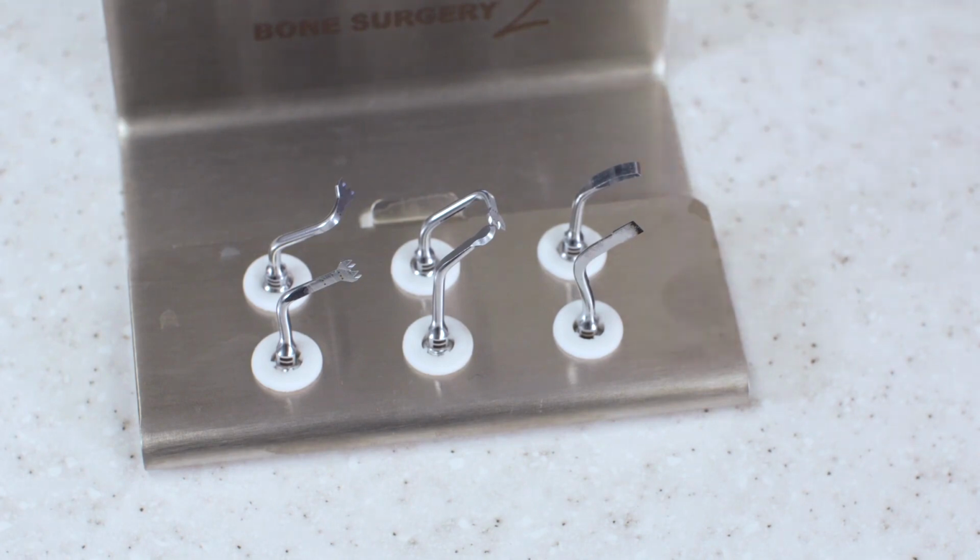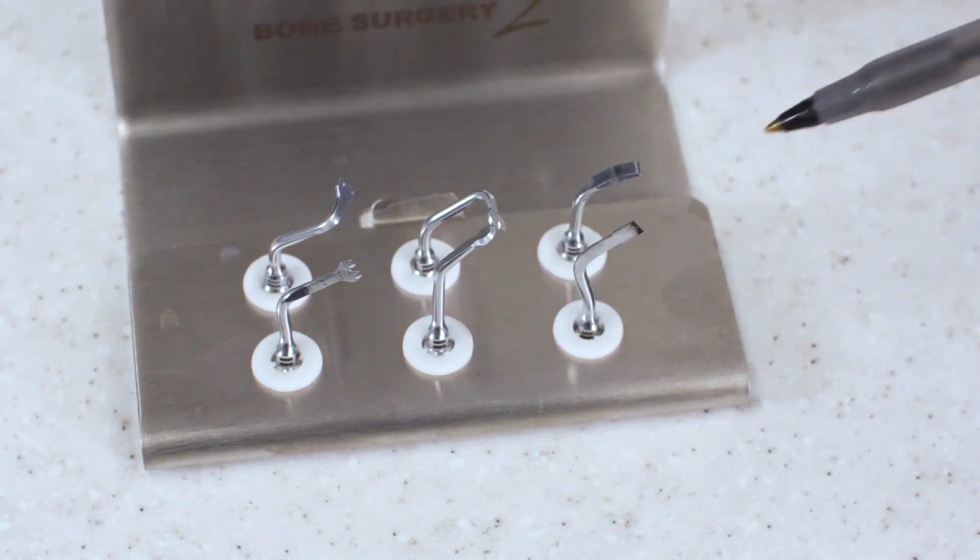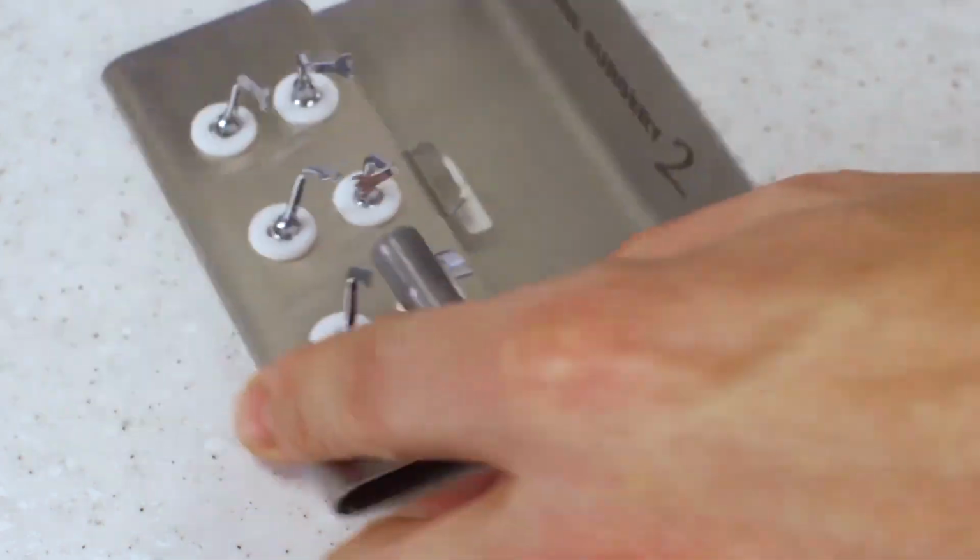So we have different angles on these saws, and then different obviously angles on the scalpels as well, so that you can get different types of applications with those.